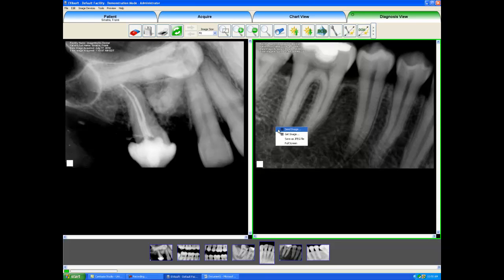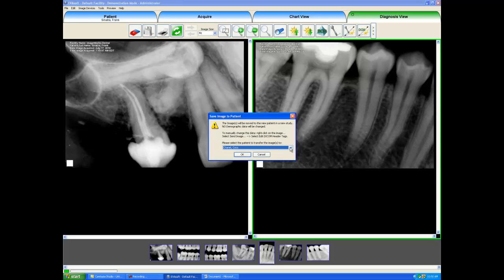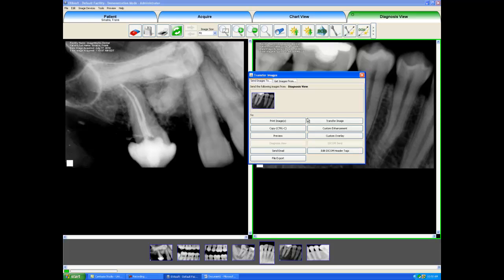The first menu item when you right-click an image is Send Image. This is to send the image somewhere. For example, I could hit Print Image and send it to a printer, or I could send it to a different patient had we taken x-rays under the wrong patient's name by clicking Transfer Image. I can select on the drop-down menu a different patient for where I should send the image to. I could also select Copy so I could then paste it into a PowerPoint presentation, into a Word document, or elsewhere.